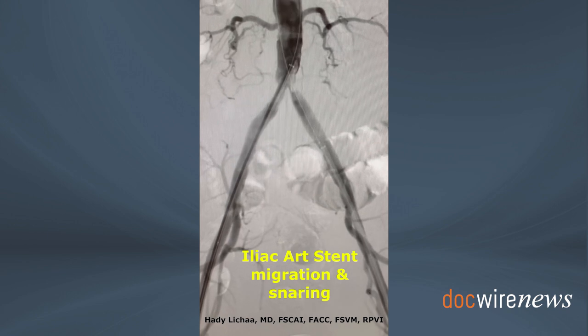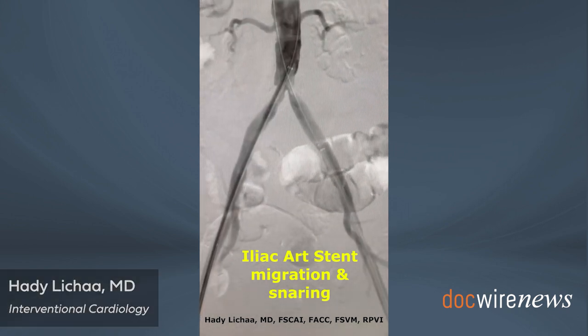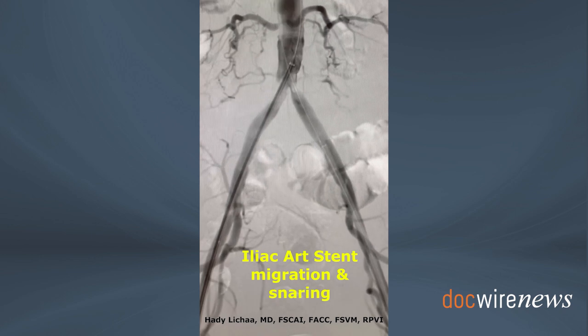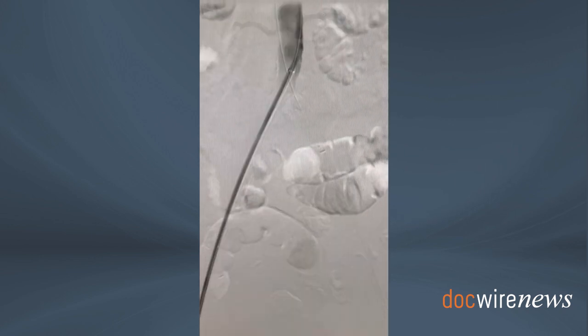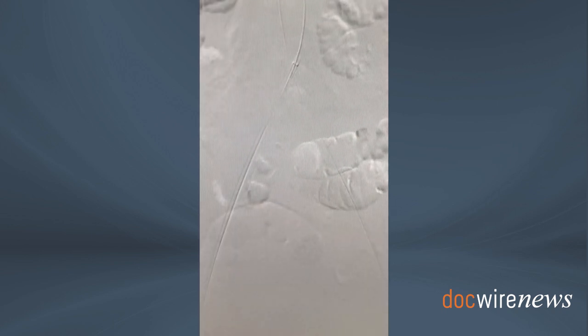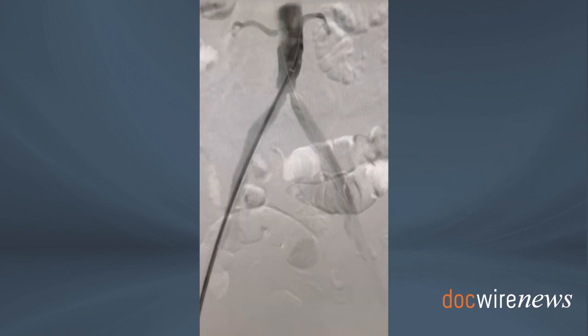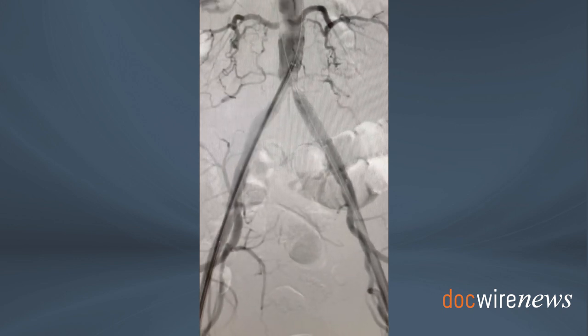This is Dr. Hady Lichaa, cardiovascular specialist, presenting a case of management of iliac stent artery migration and snaring. This is a young patient who could not rehab after a myocardial infarction due to lifestyle-limiting disabling claudication in both buttocks and thighs, which did not respond to a supervised exercise program.